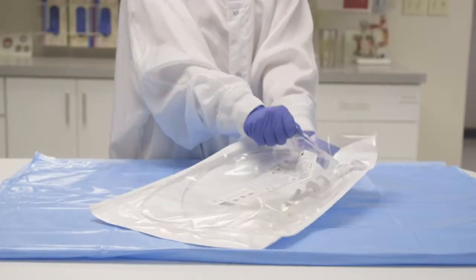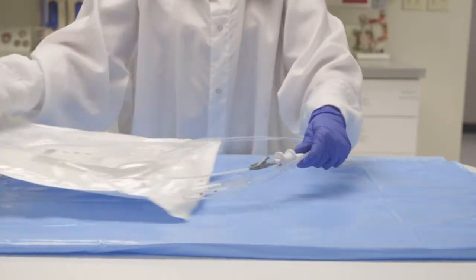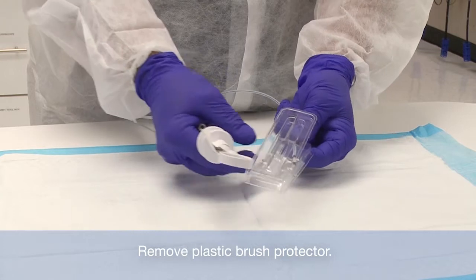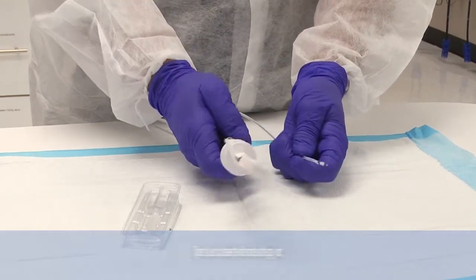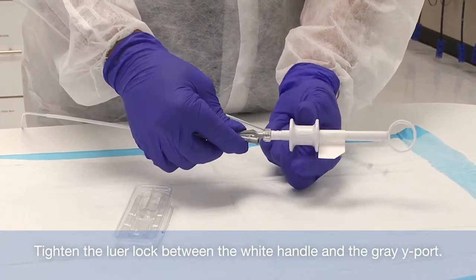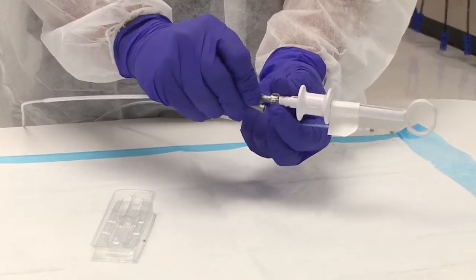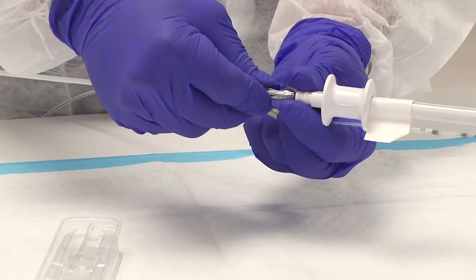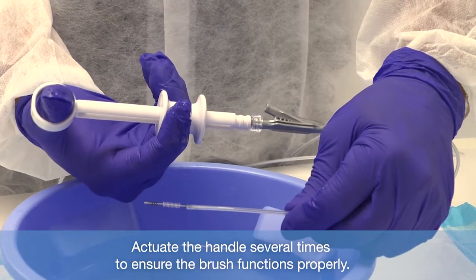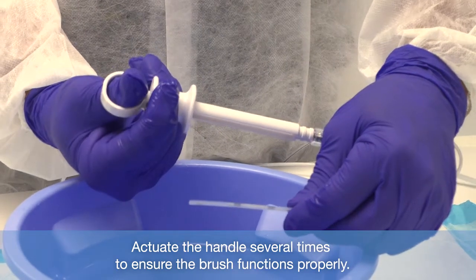Each sampling device is packaged in a plastic peel pouch. Open the sterile pouch and remove and uncoil the device slowly. Remove the plastic brush protector from the distal end of the device. Tighten the lure lock between the white handle and the gray Y-port. Visually inspect the device for damage. Actuate the handle several times to ensure the device functions properly.